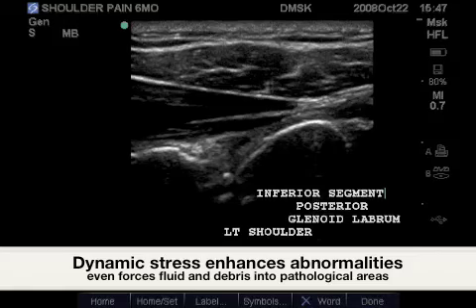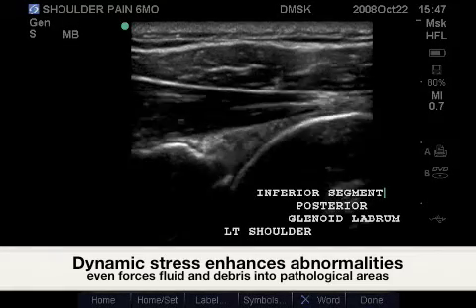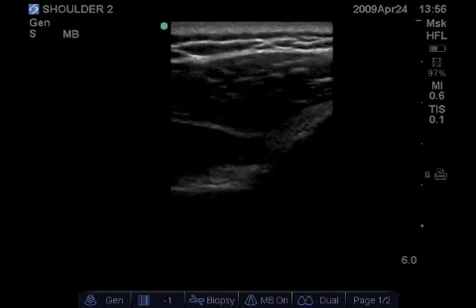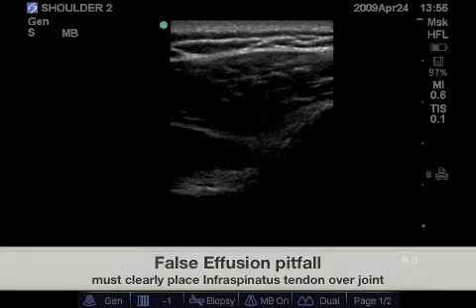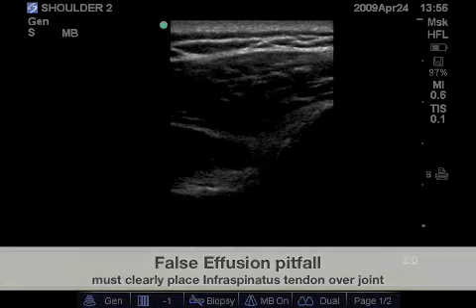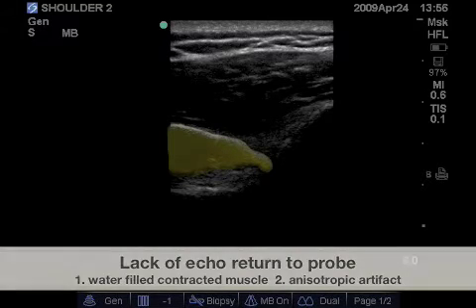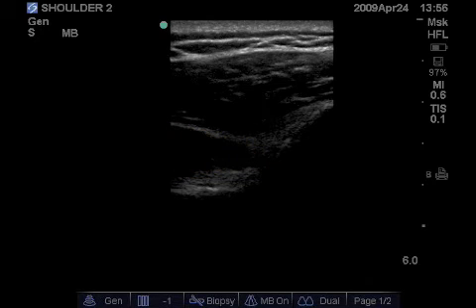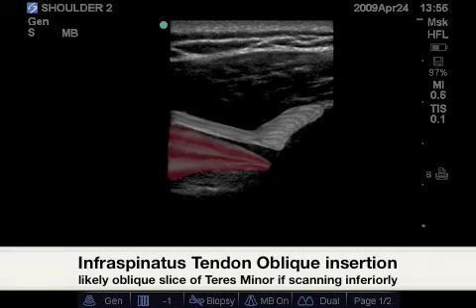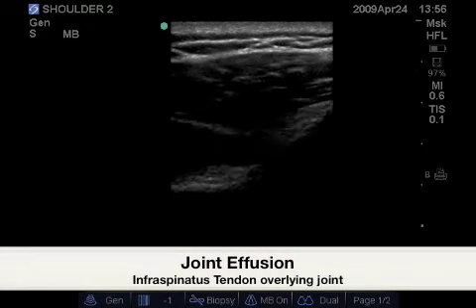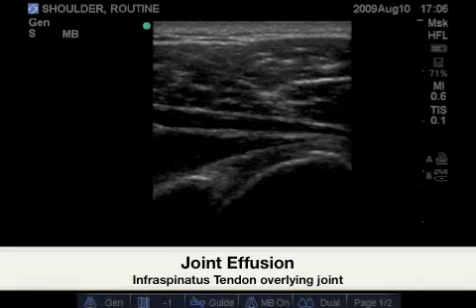On internal rotation, we may also see loose bodies deep within the joint. This image of external rotation reveals a false joint effusion — what looks like a large hypoechoic structure protruding from the posterior joint surface is actually just contracted muscle belly, which contains a large amount of water, as well as a high incidence of anisotropic artifact due to the angle of tendon insertion.